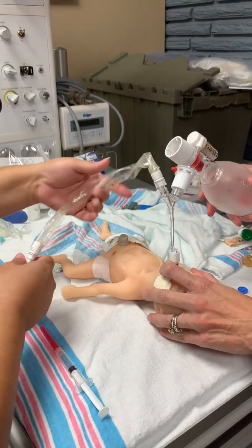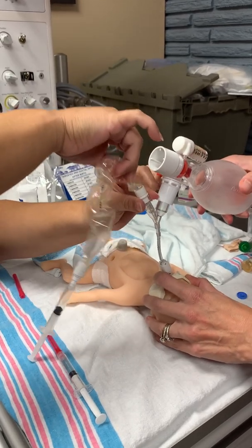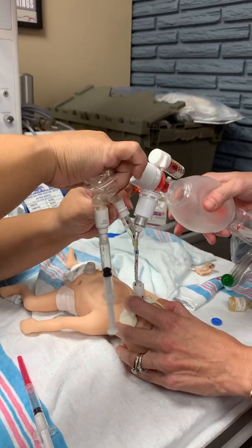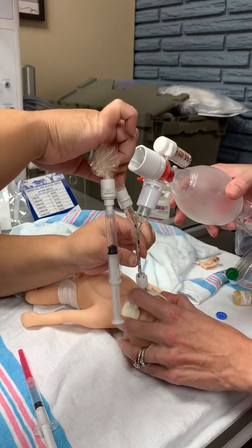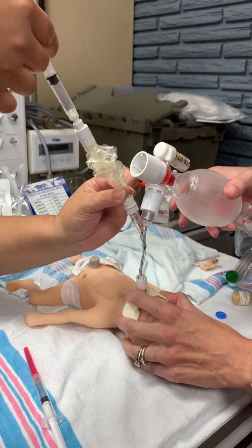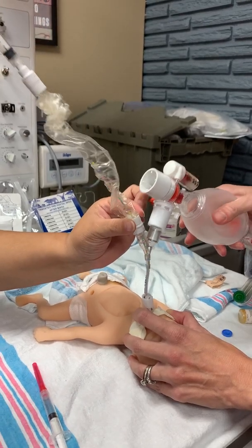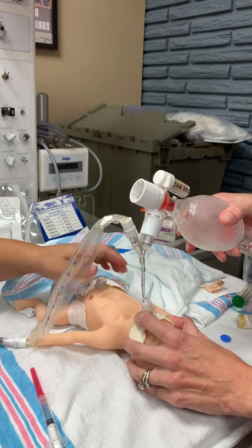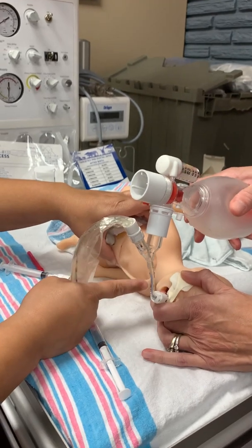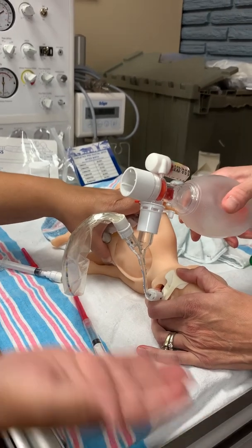So I'm going to advance, just like I would advance suction. I'm going to match my numbers up to my numbers on my tube. So I'm looking for 15, and I'm gonna match 15. There, that's the appropriate distance. So now I'm going to rapidly give the surfactant with my air bolus behind it already set. Give it rapidly. Remember to remove the catheter, continue bagging, and turn my baby midline, making sure that my head is in the same direction of my body. You do not want to just turn the head or just turn the body. You want to do them together.